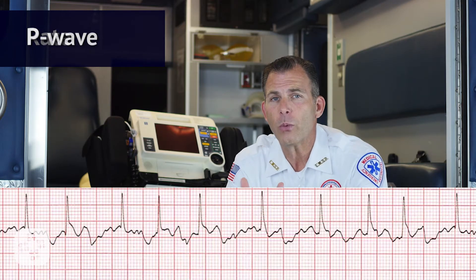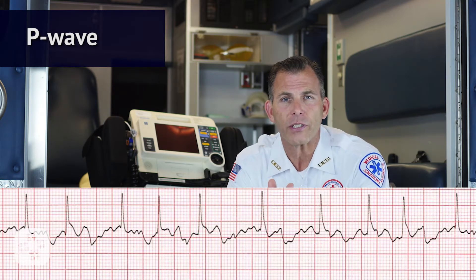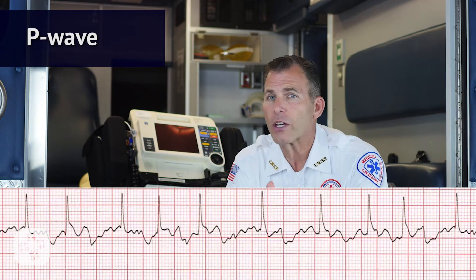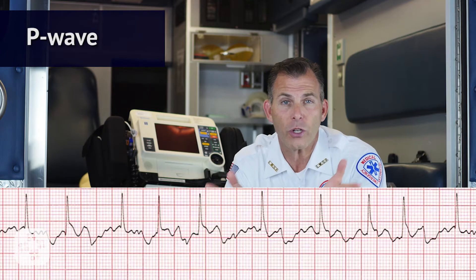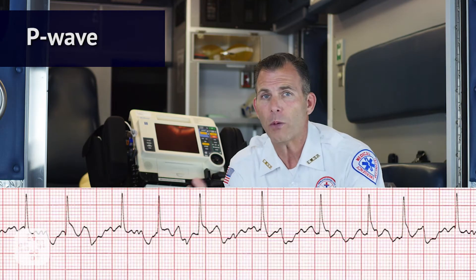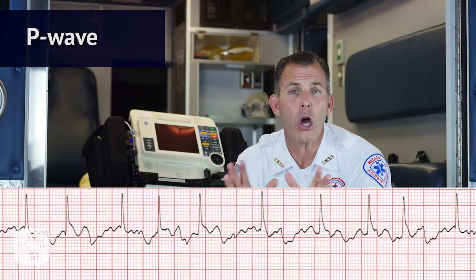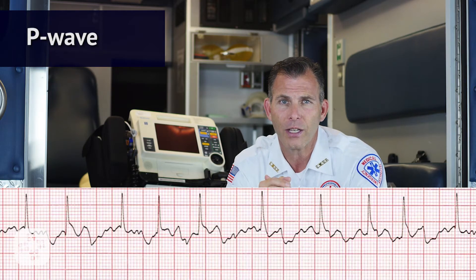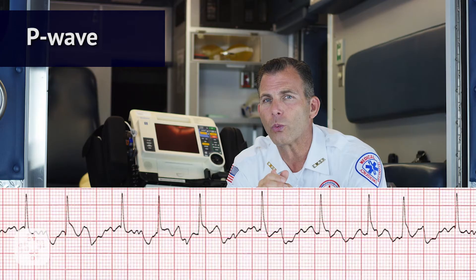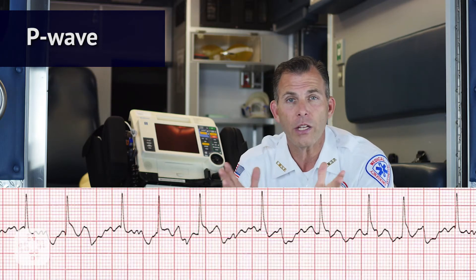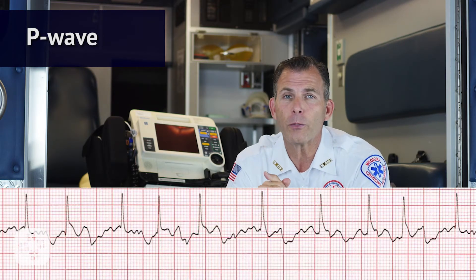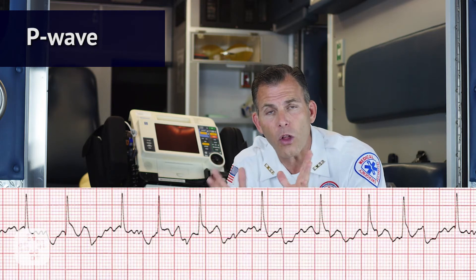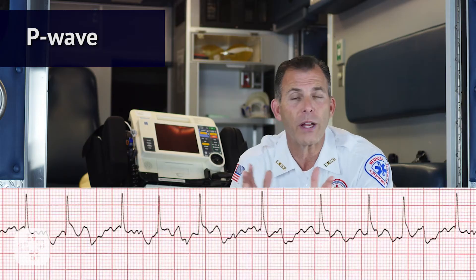Then we evaluate the P wave. Are they present? No, not in this case — the P waves are not present. Do they occur regularly? No, because there are no P waves. Is there one P wave for each QRS complex? No. Are the P waves smooth, rounded, and upright? No — only fibrillatory waves are seen. Do all the P waves have similar shapes? Again, no.